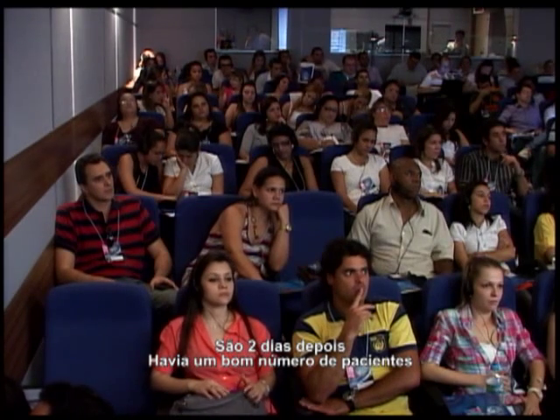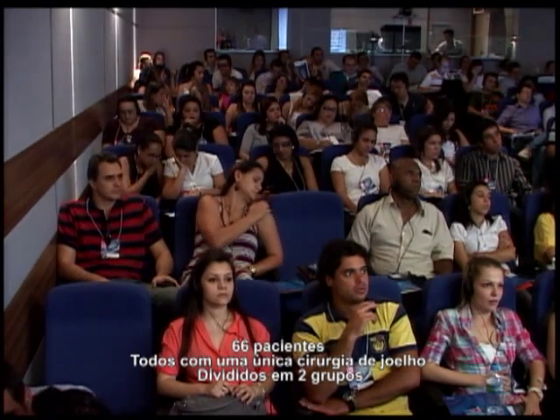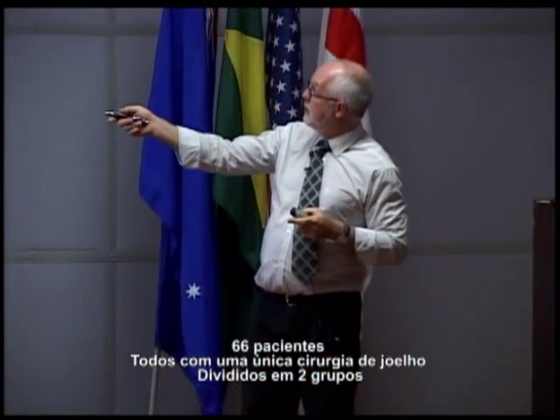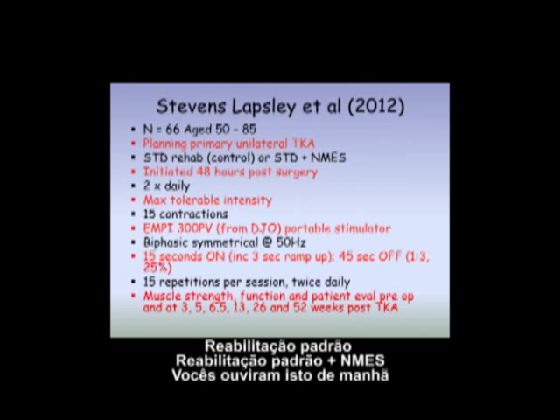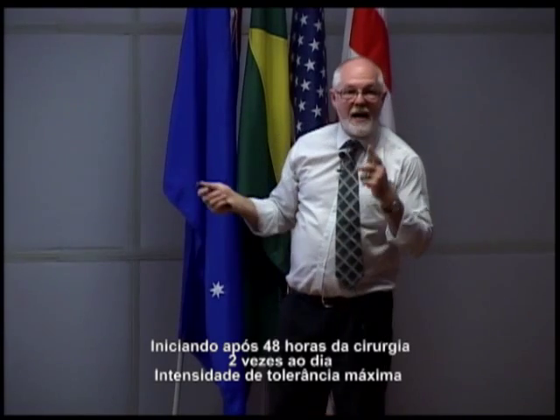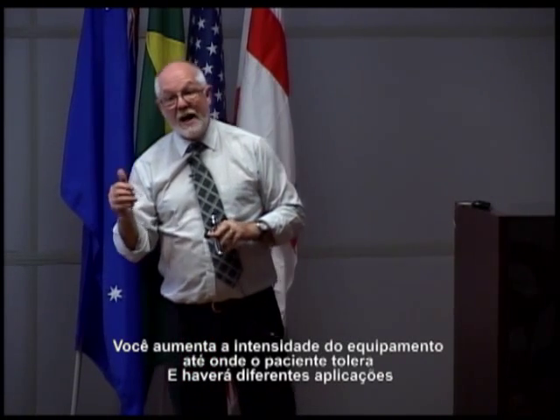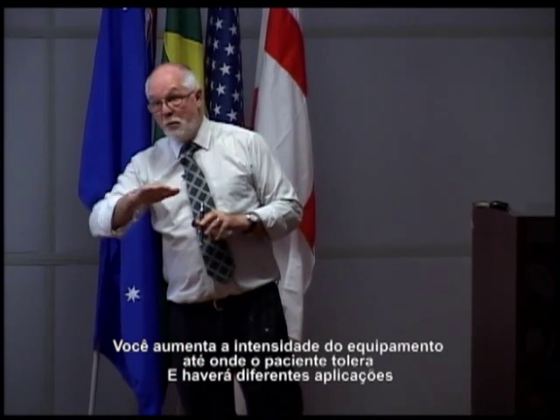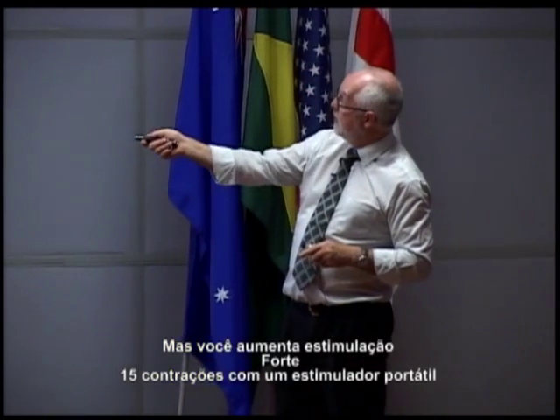So there were a good number of patients, 66 patients. They were all having a single knee surgery, divided into 2 groups, standard rehab plus NMES. You heard that this morning. 48 hours post-surgery is when they started. Twice a day, maximum tolerance intensity. You turn the machine up as much as that patient can. And it will be different for every patient. But you turn the stimulation up so it's strong.